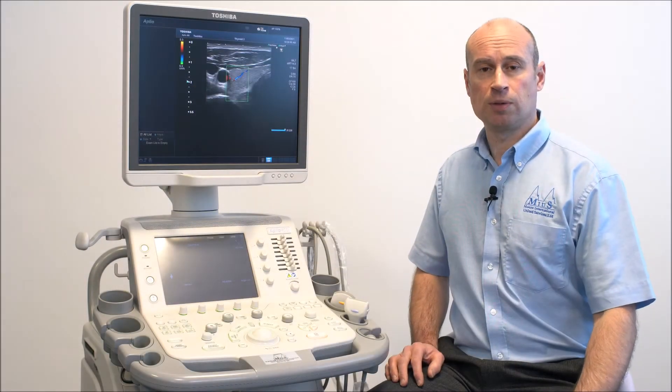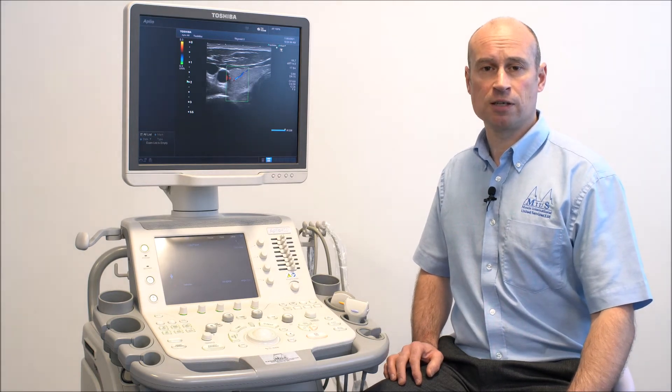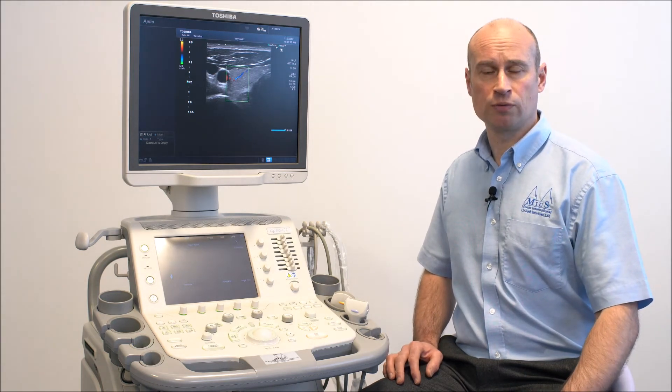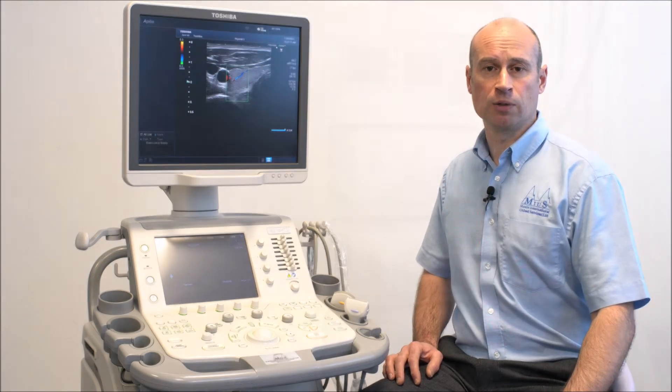The highest specification Toshiba Aplio series scanners come with a wide range of features designed to enhance the image quality and allow you to optimise the image with ease. Standard imaging modes include B-mode, M-mode, pulsed wave Doppler and colour flow imaging, with the option of continuous wave Doppler available in some systems.